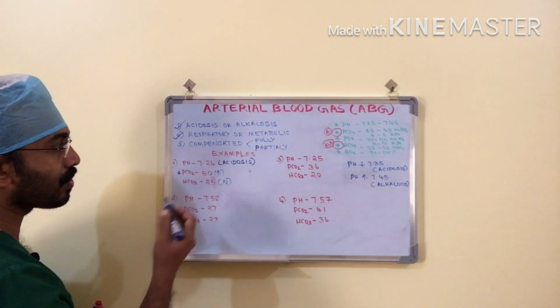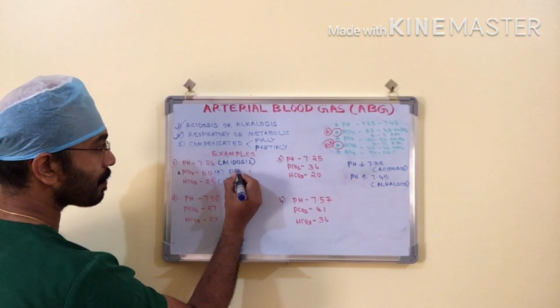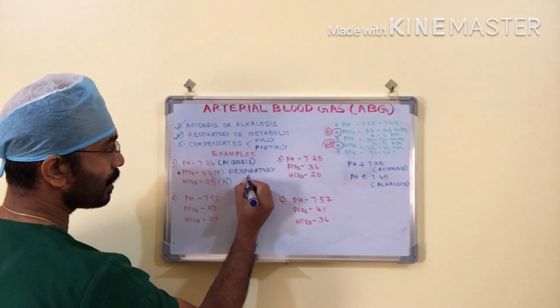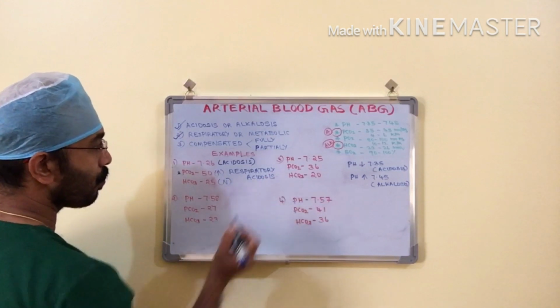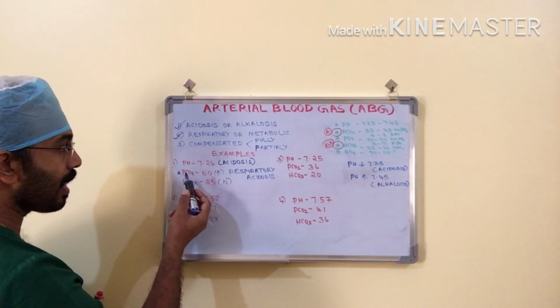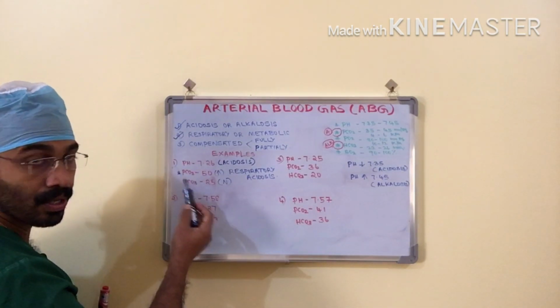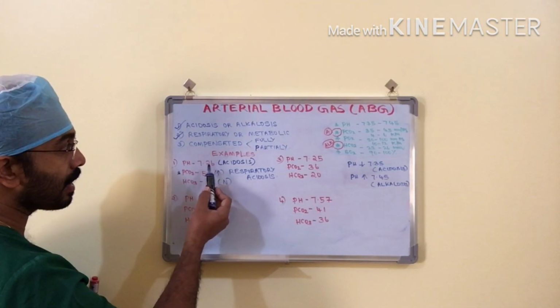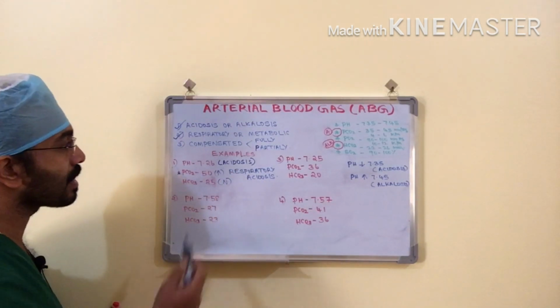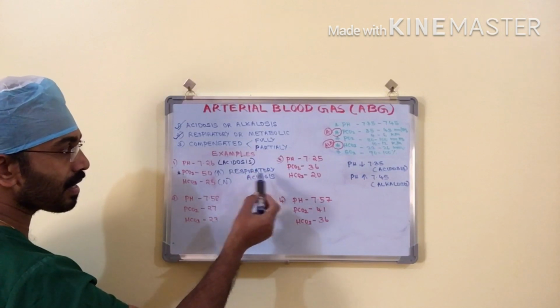In this situation, we can go directly to the ABG interpretation, that is respiratory acidosis. Why? Because the PCO2, whose regulatory mechanism takes place in the lungs, is also an acid, with a good relation to the hydrogen ion. So because of this, the blood acid has been raised and the acidosis has happened. So we can interpret this as respiratory acidosis. The pH is low, acidosis, and the PCO2 went up, it is respiratory acidosis.